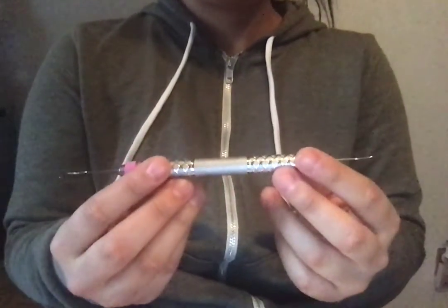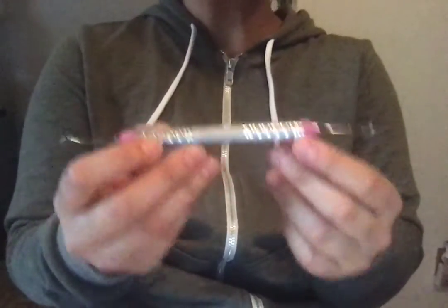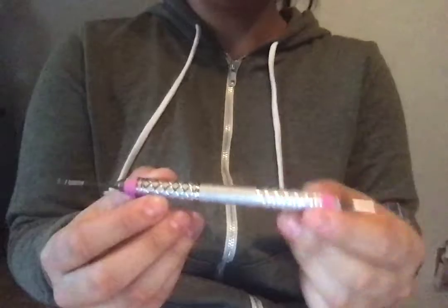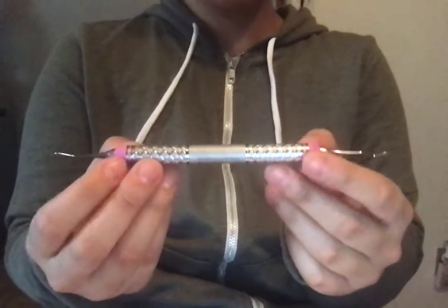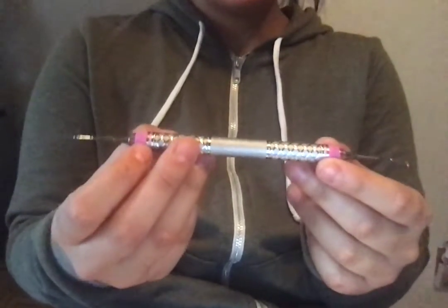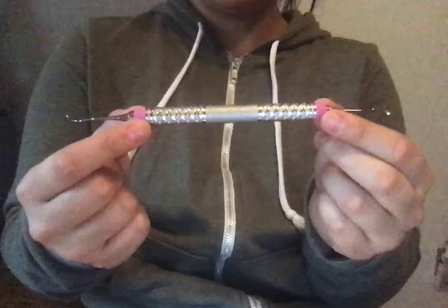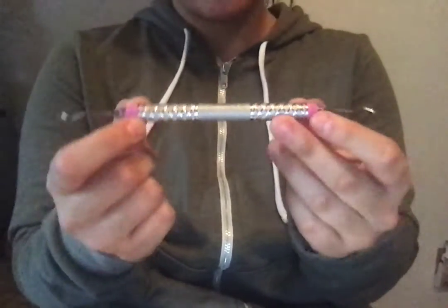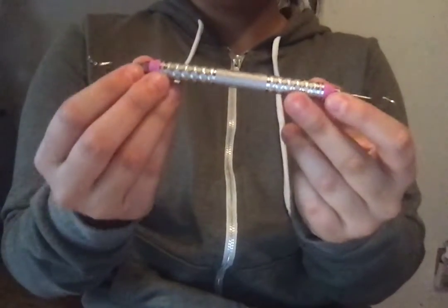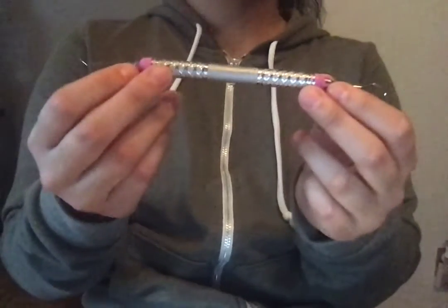Today we're going to be talking about the Columbia 1314. This instrument is used subgingivally in any area of the mouth. The indications for the Columbia 1314 are that it's for small to moderate calculus. The contraindications for the Universal Curette and any other scaling instrument is for green stains because of underlying de-mineralized enamel.